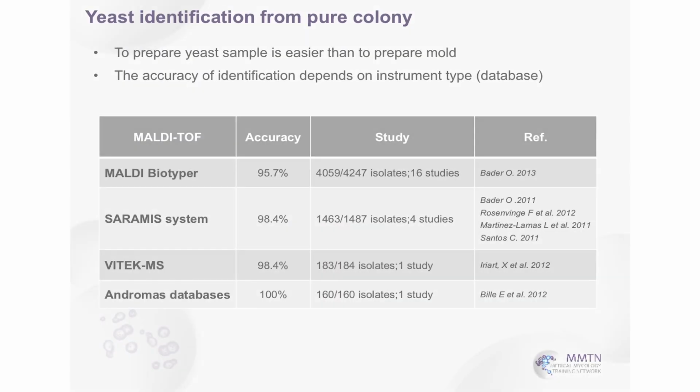Normally the fungus is very fussy and very difficult to work with. So you start with something so cute, only unicellular, where we have a bit of control of the organism. Here, we start with the yeast, with the pure culture. Preparing the yeast sample is much easier than the mold. Yesterday we had the wet lab for the yeast, but today will be the mold. So we have to start up to get the energy more and more. So this wet lab in the afternoon, you will get more. Almost everything for the yeast will be easier than for the mold.